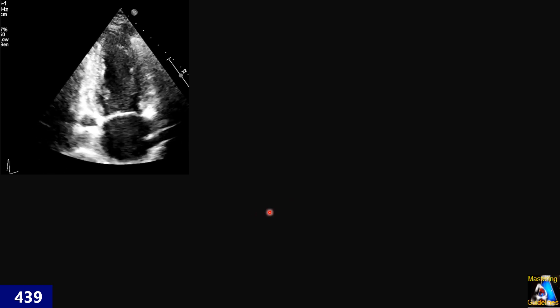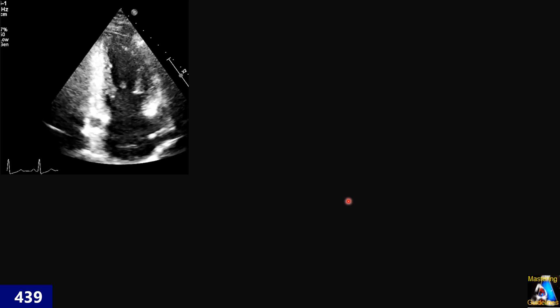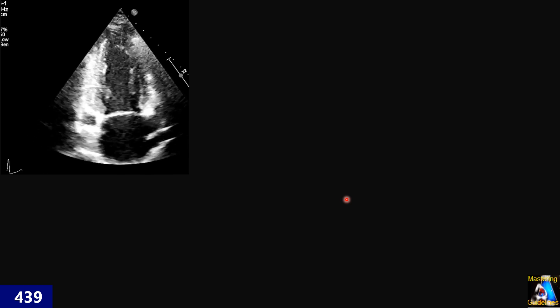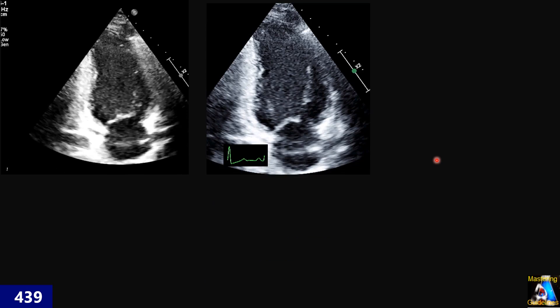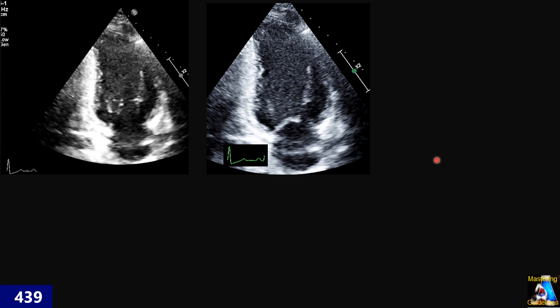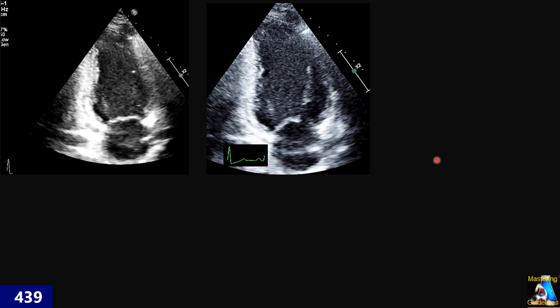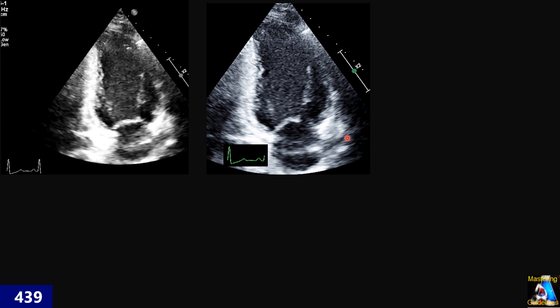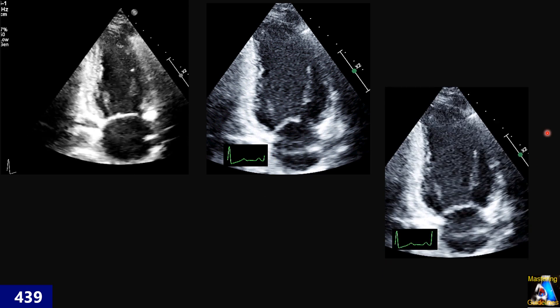So I am focusing on the apical two-chamber view. In this lecture we go through the concepts, in other lectures we practice with cases. Here we have an apical two-chamber view. Based on the definition of end-diastole and end-systole, which of these is the correct way for tracing the endocardium at end-diastole — do we go based on anatomical features or EKG?